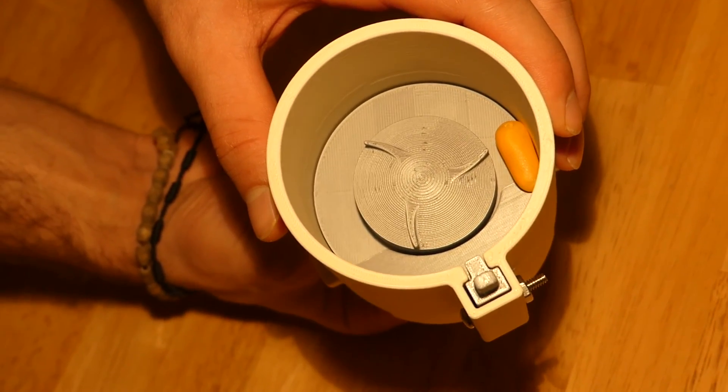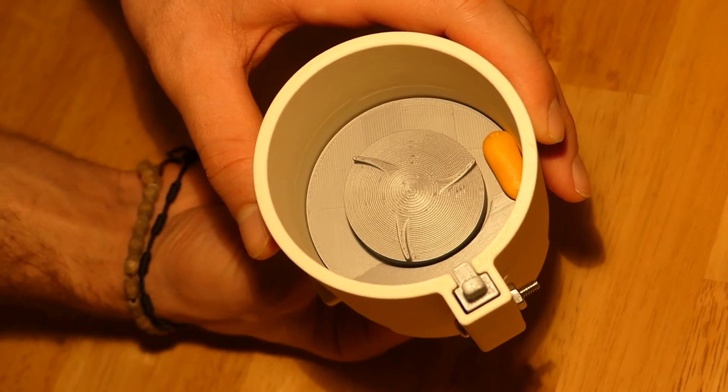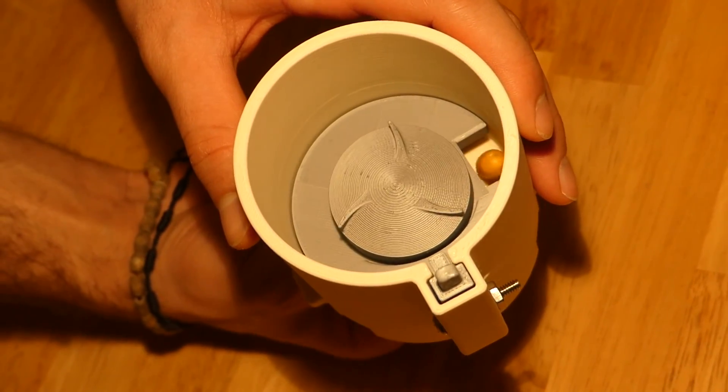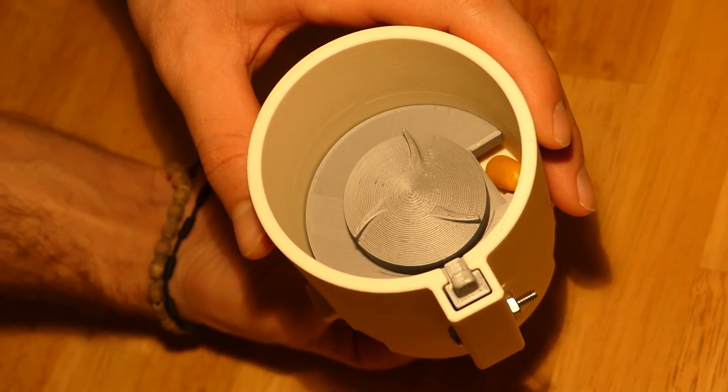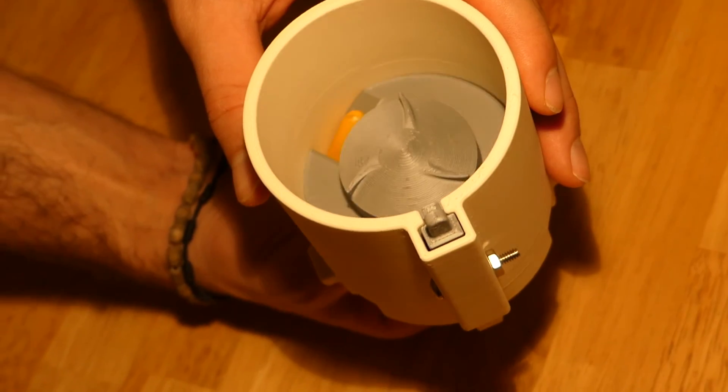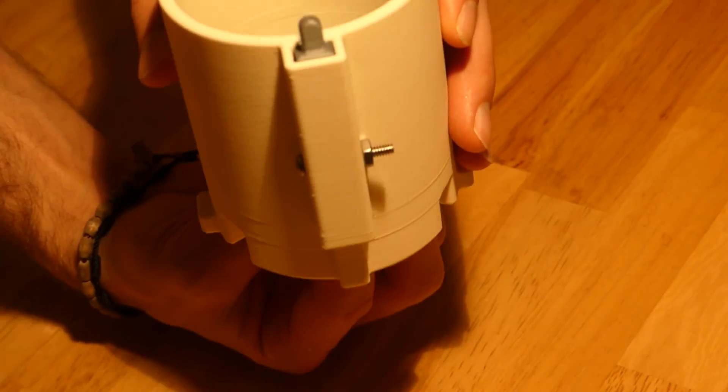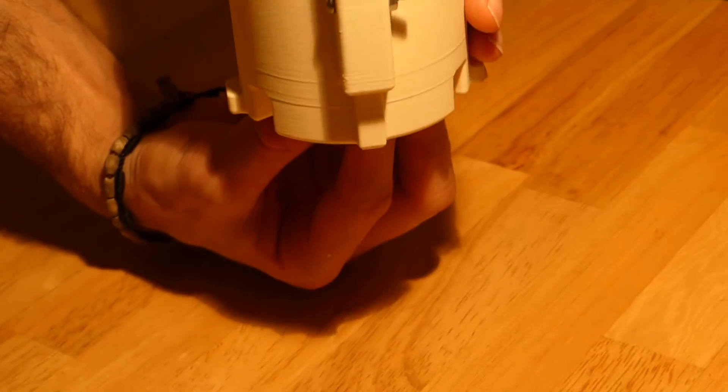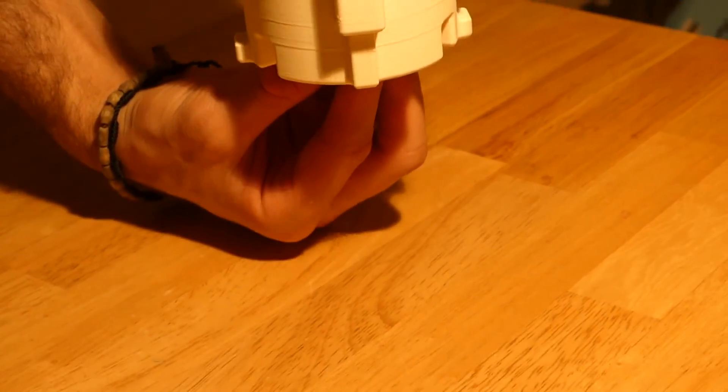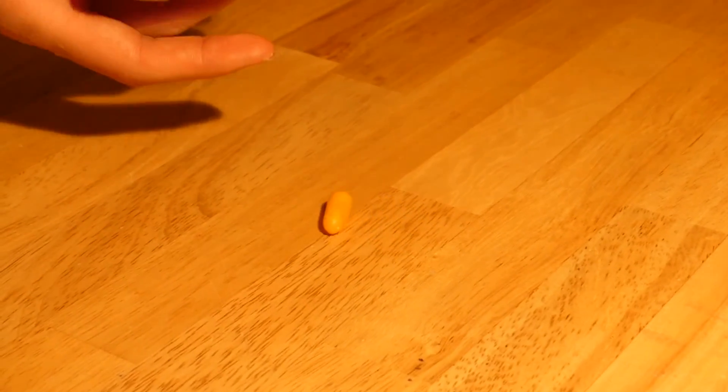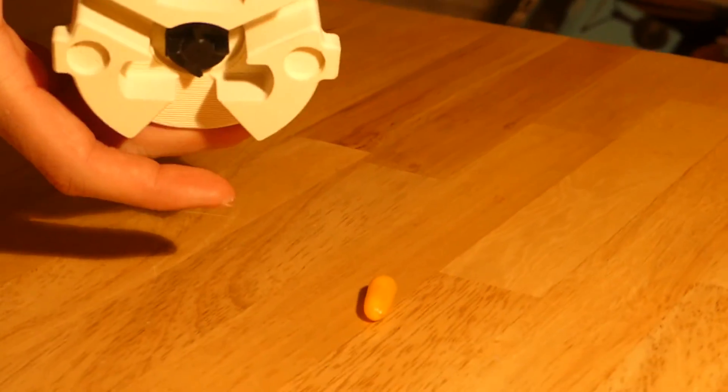As the inside rotator is rotated, a single pill drops into the hole in the rotator and once the hole in the rotator lines up with the hole at the bottom of the cylinder, the single pill dispenses.